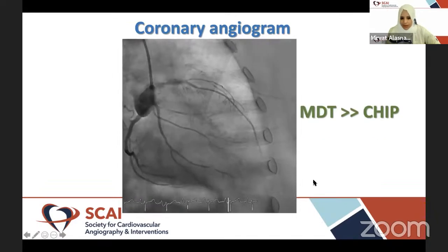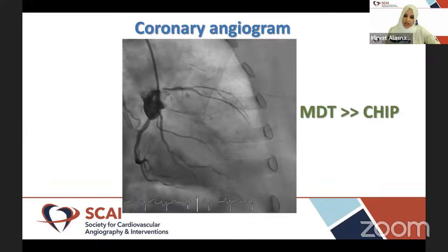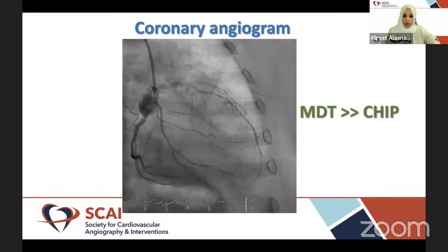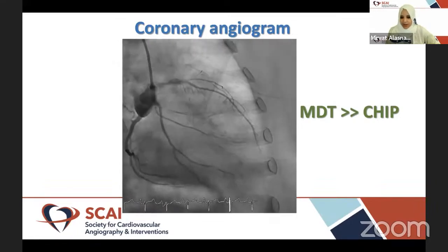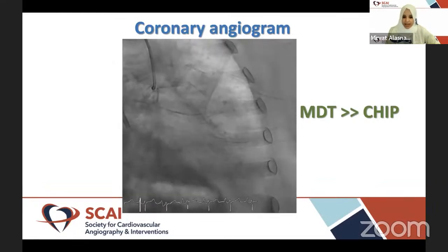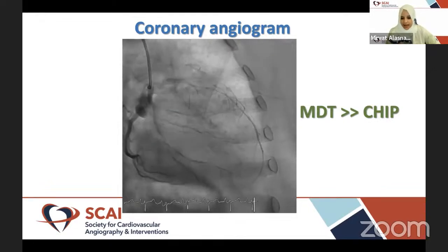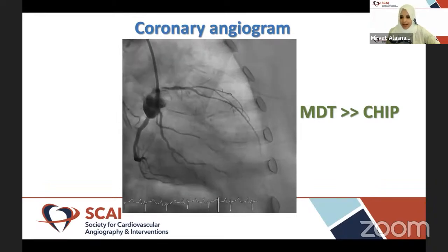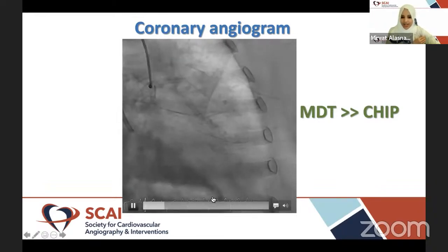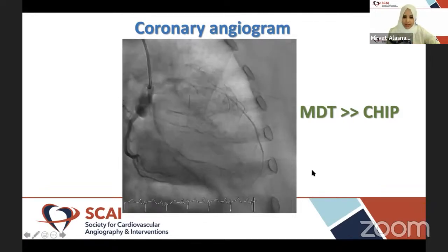We had a multidisciplinary team meeting, and we usually have those in the cath lab, especially if the patient is being cathed during the daytime. We called the surgeons in, and we had quite a discussion because we do feel the targets are actually good. It's a heavily calcified lesion. We would have to stent back into the left main, but with her comorbidities, they really did not want to take this patient, and with the slow flow, an immediate decision had to be made for this kind of patient.